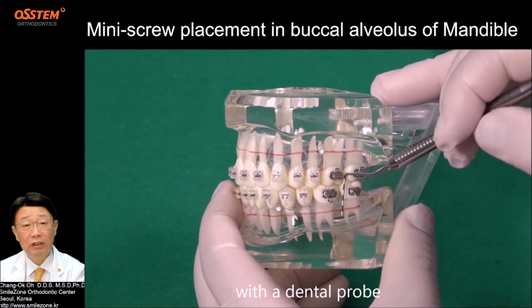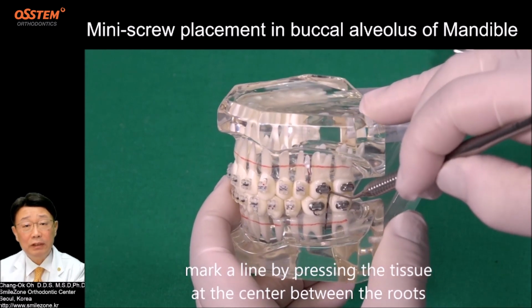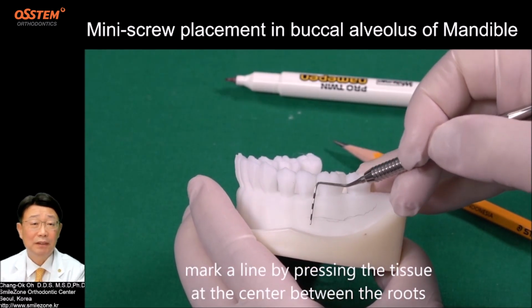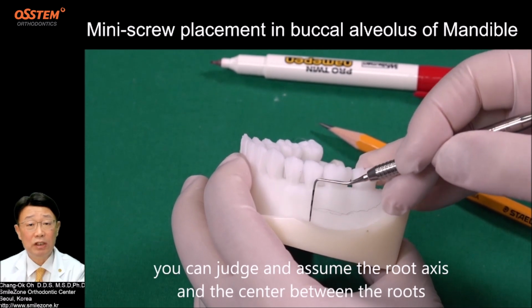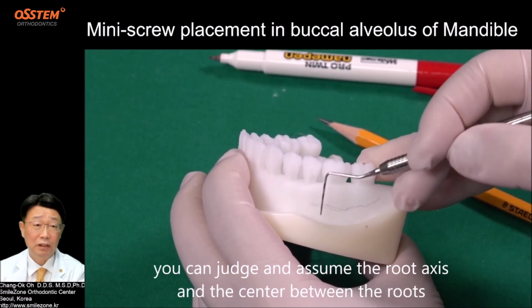Step 2. Mark a vertical line. With a dental probe, mark a line by pressing the tissue at the center between the roots. By referring to a panoramic or periapical X-ray, you can judge and assume the root axis and the center between the roots.